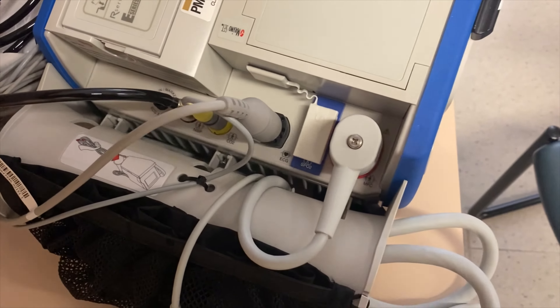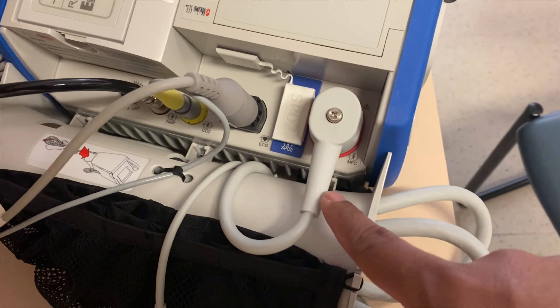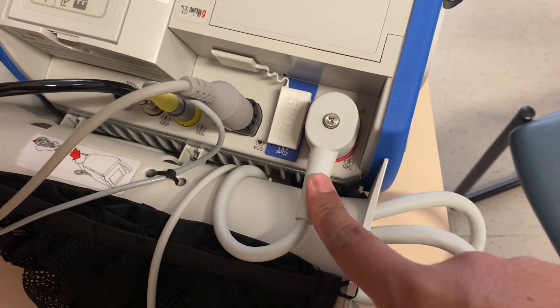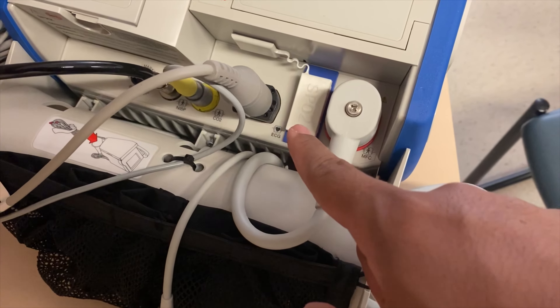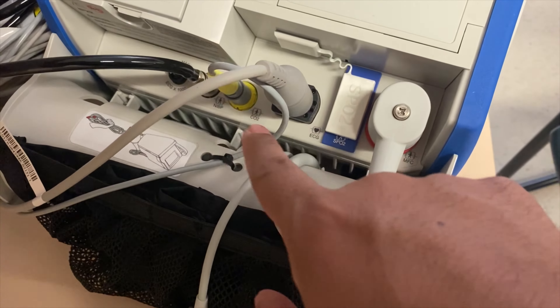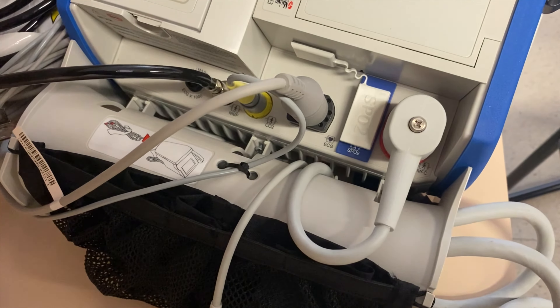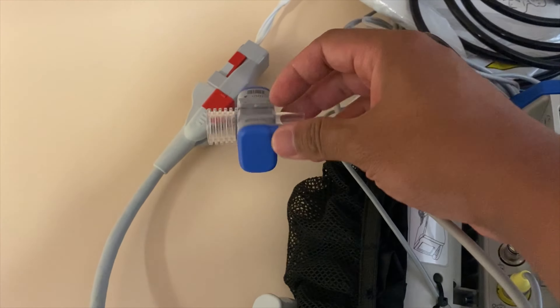At the back of the monitor, you will have different cords. This big cord here is where the electrical flow would be during your treatment. You have your SpO2 cable there. You will have your ECG leads here, and the end-tidal — the yellow one. And you have your blood pressure cuff in there. This is the end-tidal CO2 connection.